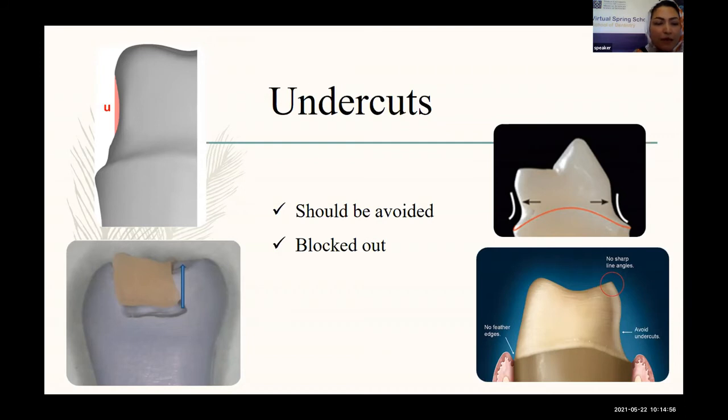But as you can see in the picture, if the undercut is in the vicinity, very close to the external surface of your preparation, it would result in open margins. You can use your software's mill preview, or I think the undercut check in the milling machine, to prevent these features or to correct them.